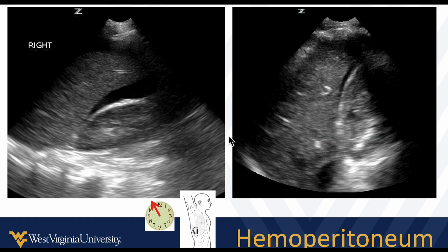And then these are kind of the classic images that you've all probably seen before into the peritoneum. We see fluid here in Morison's pouch. It's all around the liver here. Here's a much more subtle example where we see just a little thin stripe of fluid in Morison's pouch, but that's a positive examination.